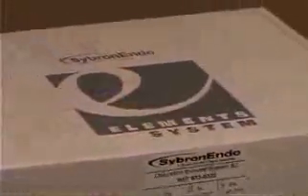Here's one of my favorite parts of getting a new toy — opening the box. Let's see what's inside there: your instruction manual and the unit itself.